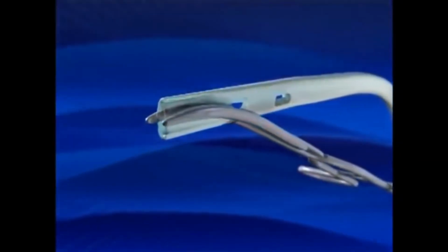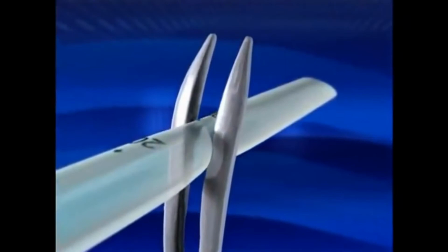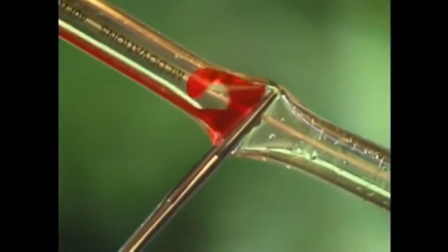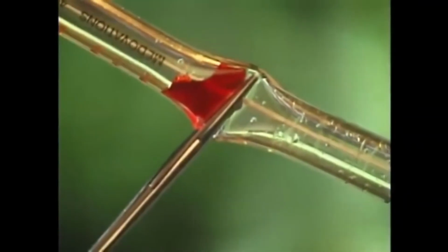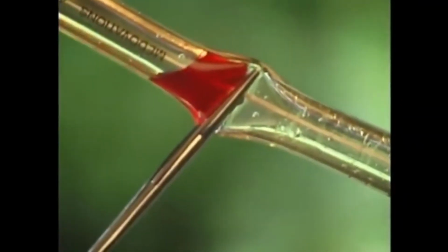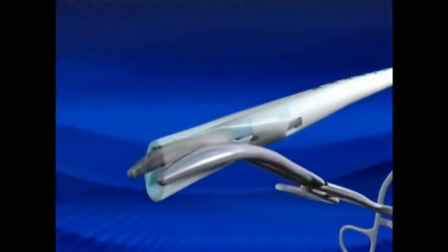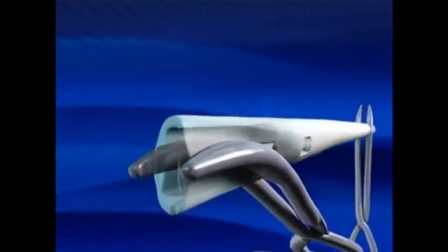Clamp the proximal and distal ends of the chest tube before insertion. The distal clamp will prevent any blood from rushing out before connection to the collection chamber. The proximal clamp will assist in chest tube insertion but might not always be necessary or helpful.